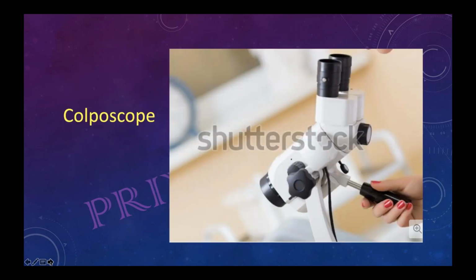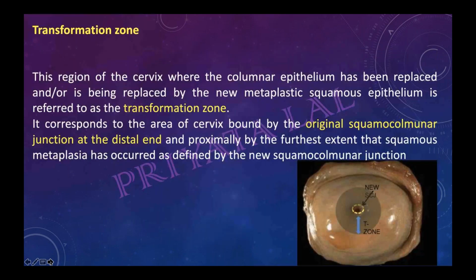Okay, now a little bit about colposcopy. It is important, and more so for part 3 people, because last April a station came where the candidate wanted to know how to do colposcopy and its details, because he was your GP trainee. Because of that I have put some details of colposcopy here. All these things can be asked of you, as it was a teaching station, so it is important.